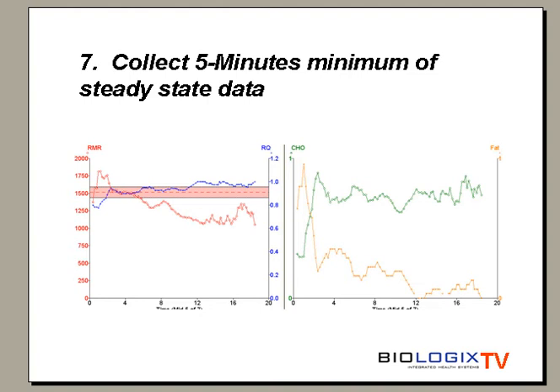No assessment should go longer than 20 minutes, and if the client doesn't show a steady state by that time, they may not. Check in with them after the assessment, ascertain if they were distracted or fidgeting in any way. Get the best information you can by then excluding that first 2 minutes of data. Use your exclusions to get a steady state you believe best represents them at the time of the assessment.